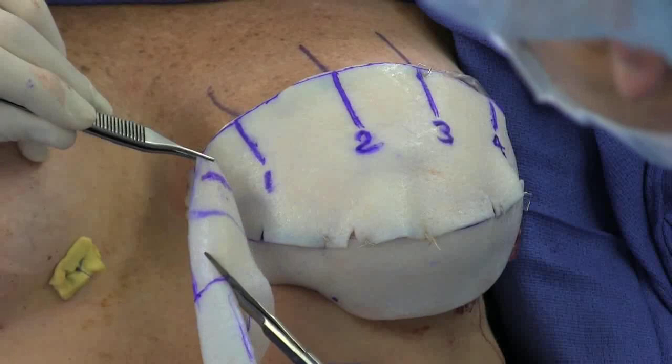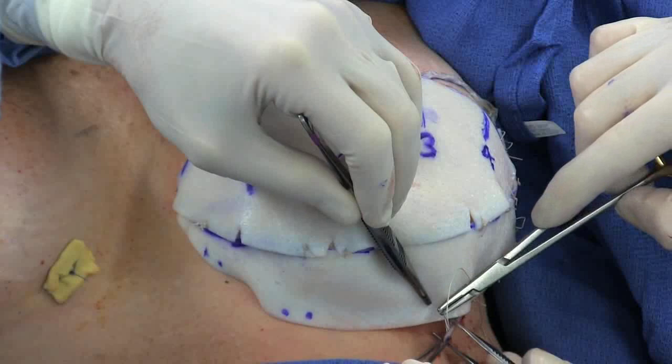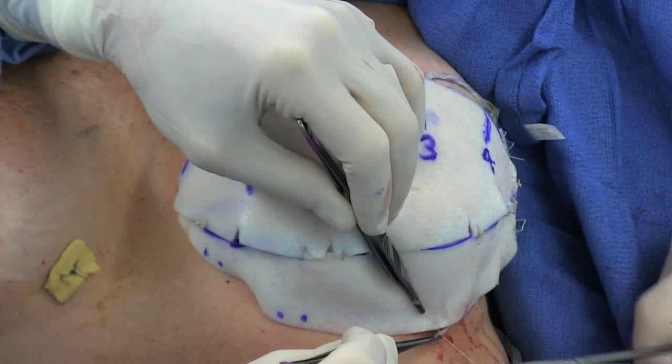In this case, a third piece is fashioned for the lateral part of the breast. This final piece is then sutured to the other two.